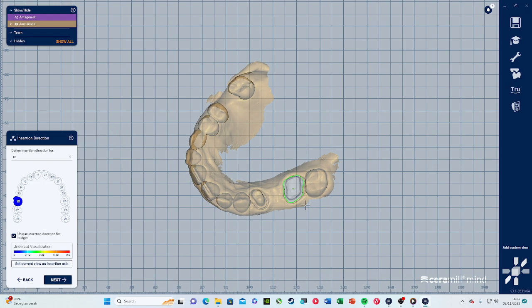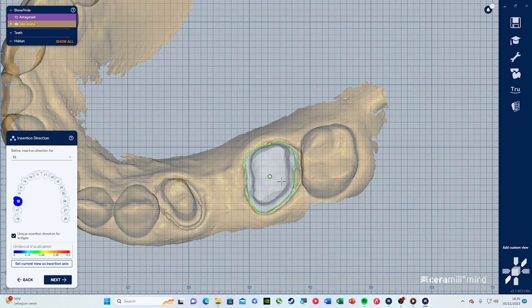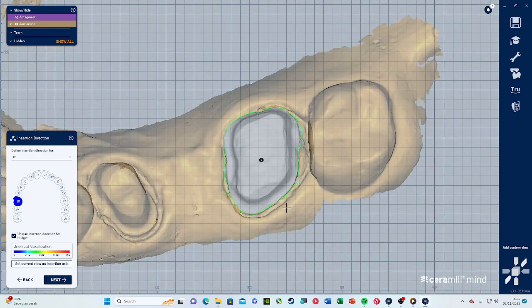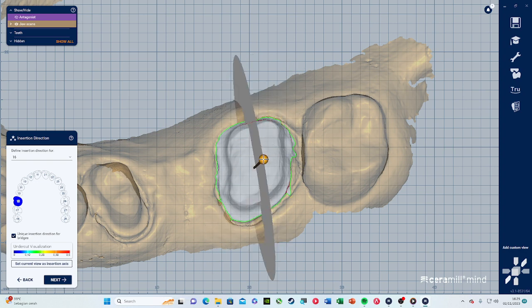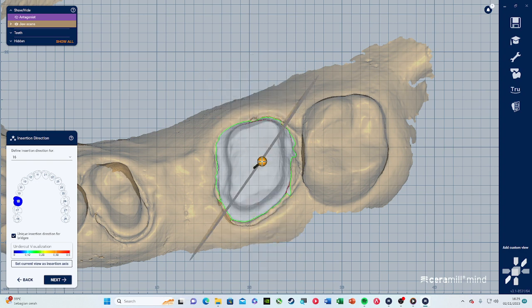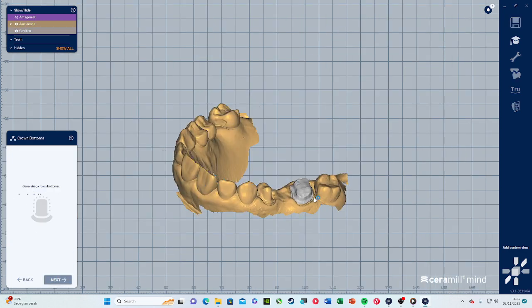Insertion direction is also important — you want the software to understand where you're going to be inserting the crown from. This tooth is straight up so you would insert it from the top, and that looks pretty good already. You could always change the insertion direction if you need to, but here this is already very good. Press next.